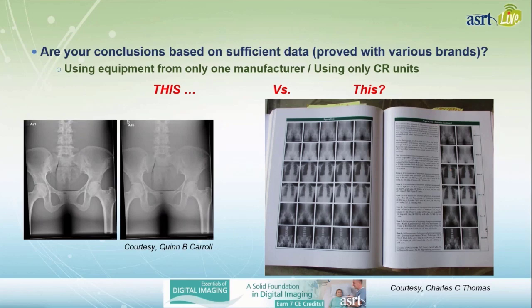We all know that. And so what you cannot do is give a presentation and use these images on the left, a single example from a single, maybe you have only one brand of equipment in your lab. You can't take a single brand of digital equipment and draw a bunch of conclusions that we're going to generalize to the whole world when you have 13 different manufacturers with 13 different patented algorithms for processing.